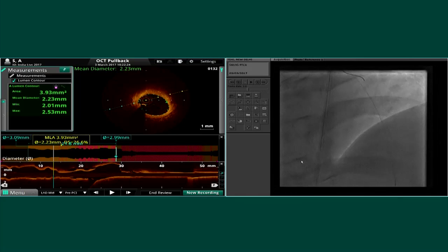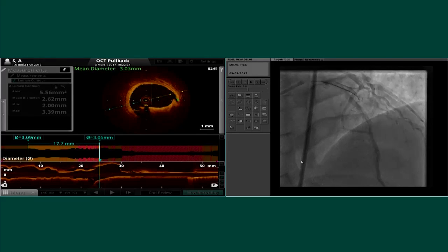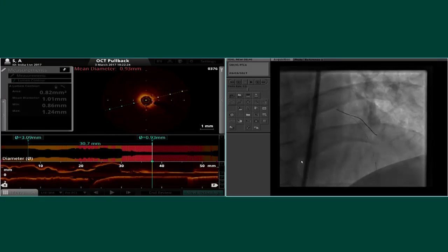For me, close to the 8 millimeters from the pullback. And then we have to see how we have to extend proximally. So this is the flush from the catheter.